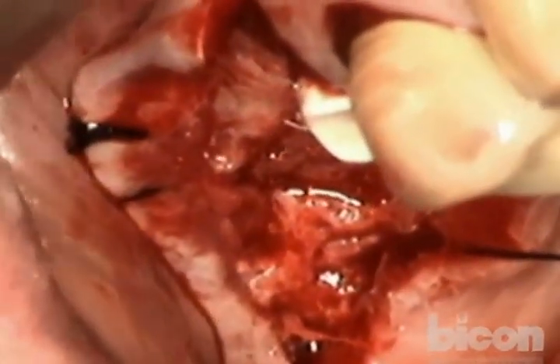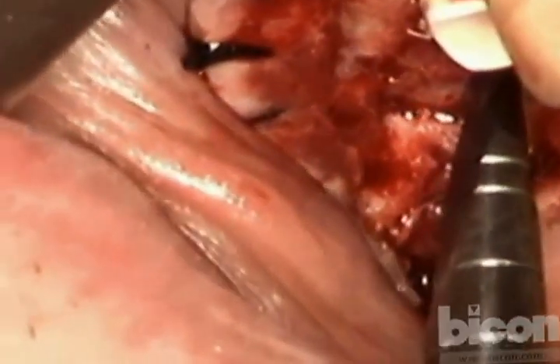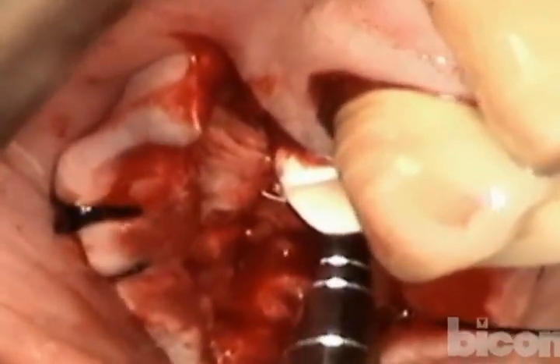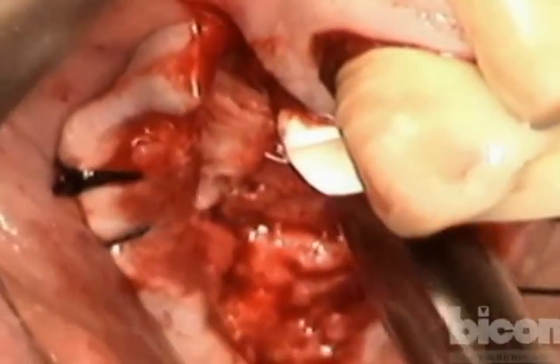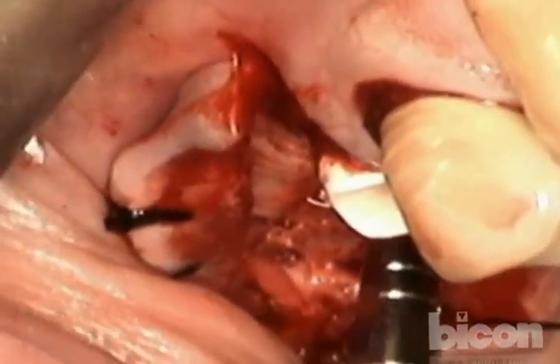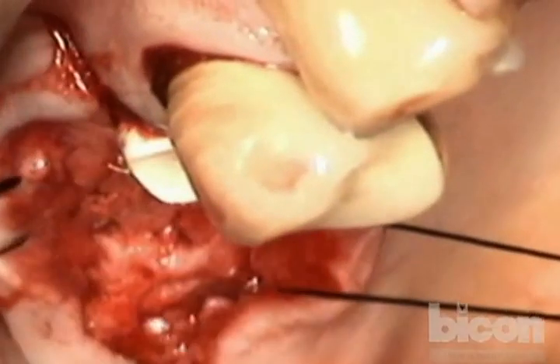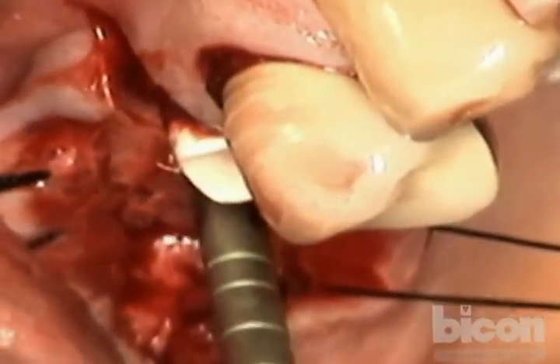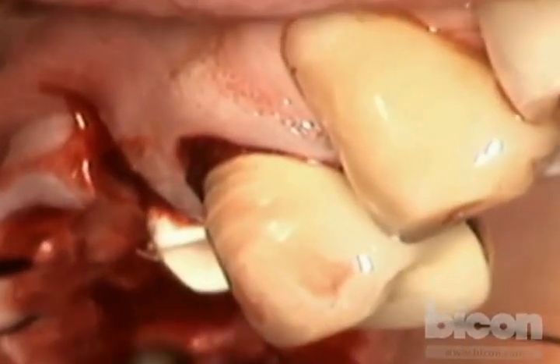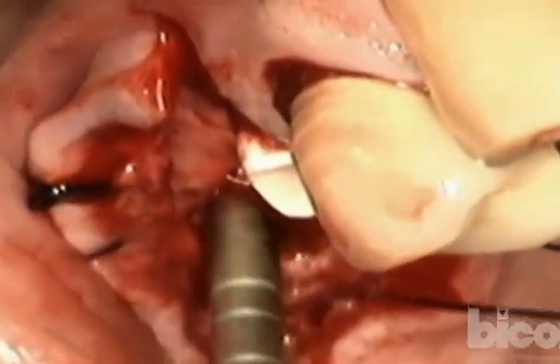The one area that's not giving in is the palatal cut. I'll just reinforce it. And that may be just because of the palatal slope of the sinus cavity or sinus floor. Either way, it will eventually fracture. We just need to make sure that that is in a controlled manner. It's moving already. Suction chamber. Good. So we will continue.